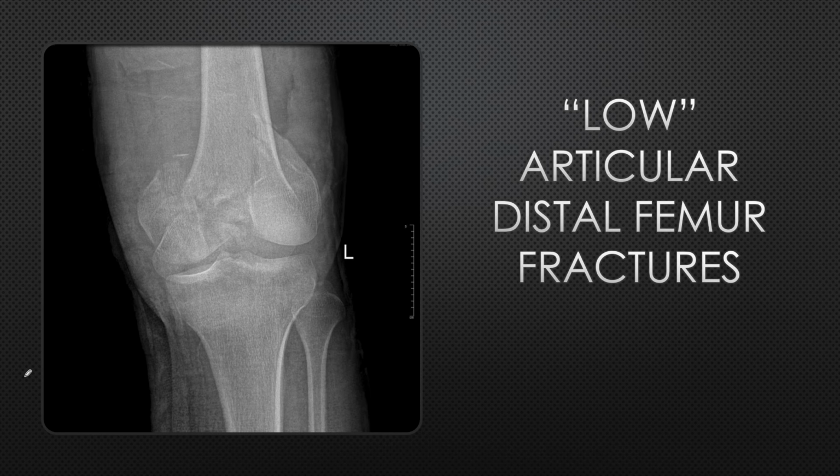Now we are moving from the lateral side towards the medial side. This is the lateral condyle of tibia, and this is the lateral condyle of femur. The lateral condyle of tibia is convex, that's why this cut belongs to the lateral side. And here we see the fracture of the lateral condyle is a bit simple, kind of a Hoffa's component we have here.